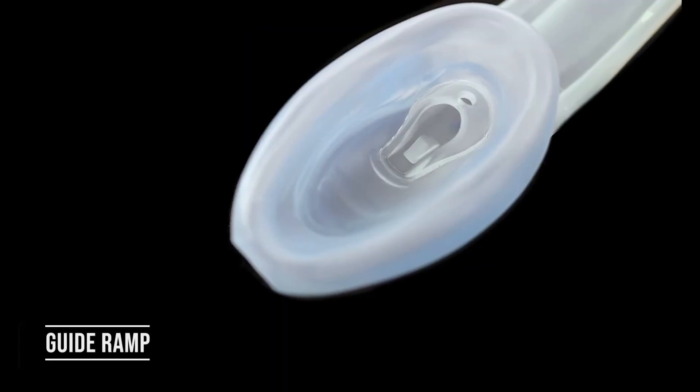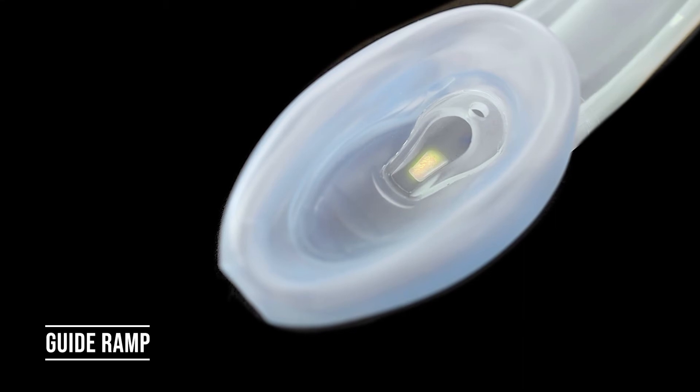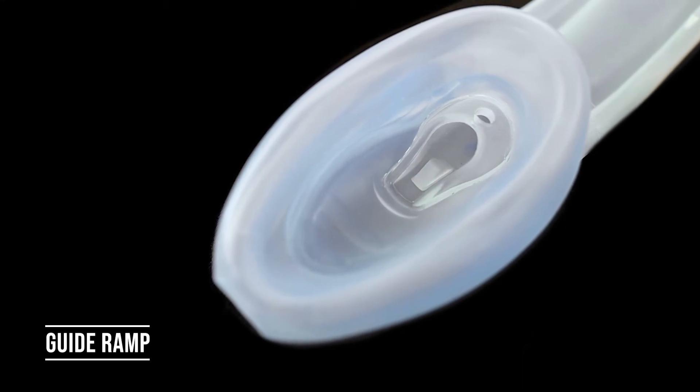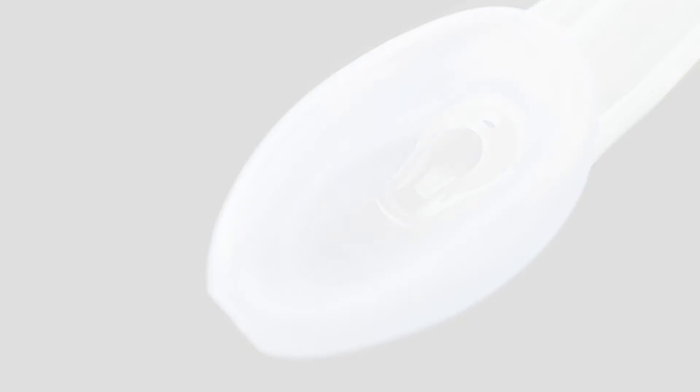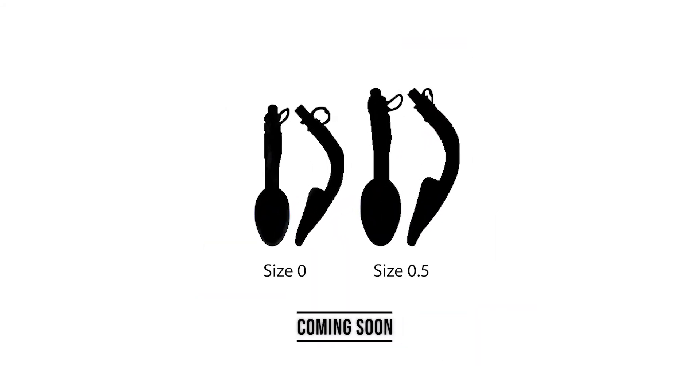Finally, a built-in endotracheal tube guide ramp helps facilitate intubation by directing it towards the laryngeal passage. The Air Q3 is currently available in six sizes with two more on the way.